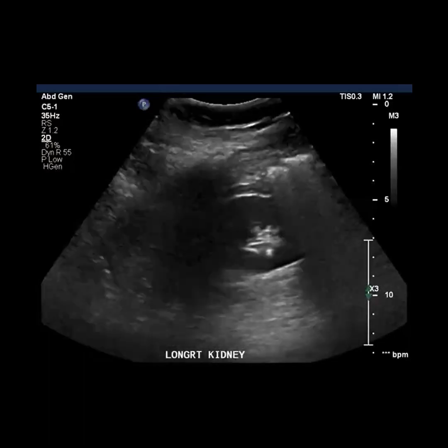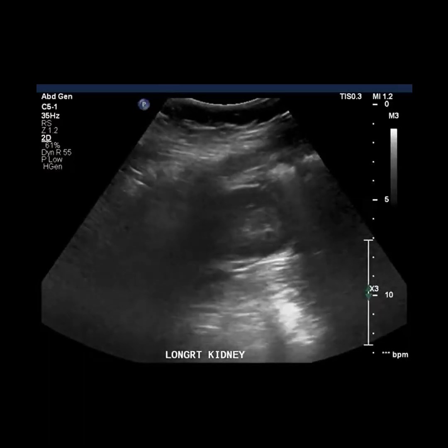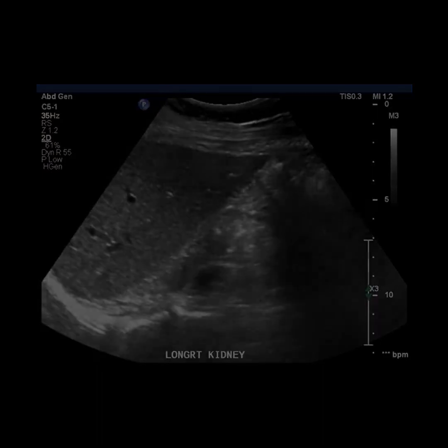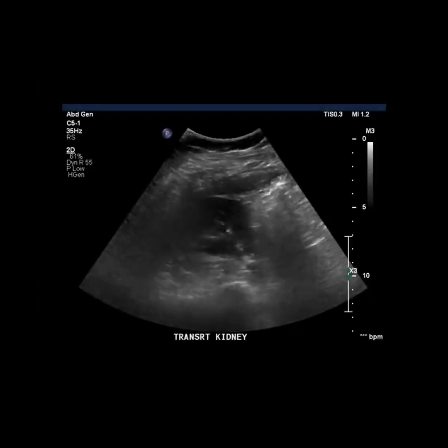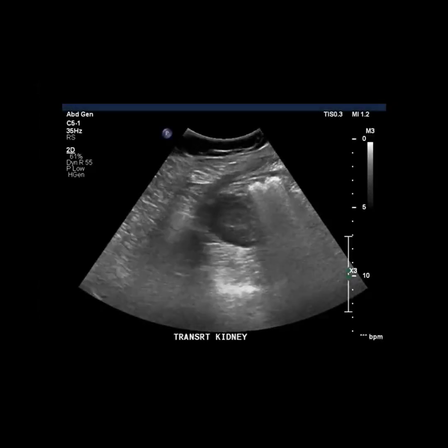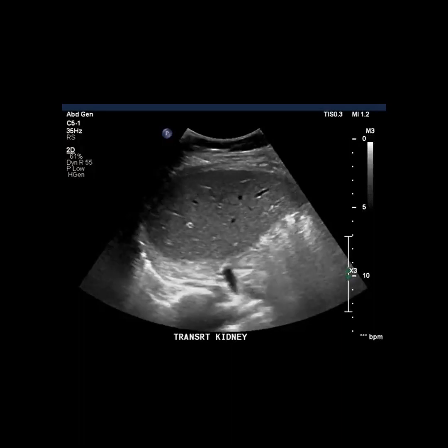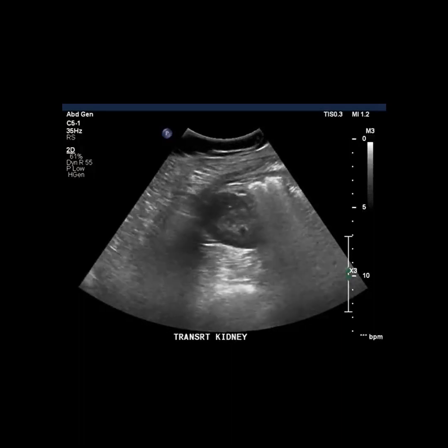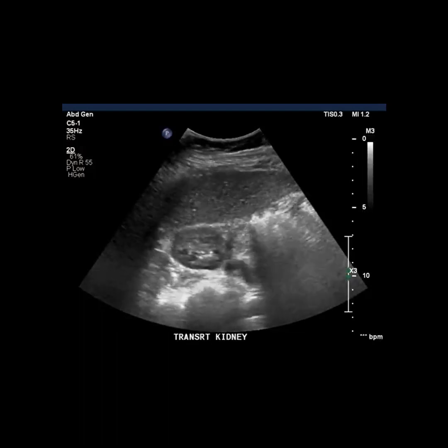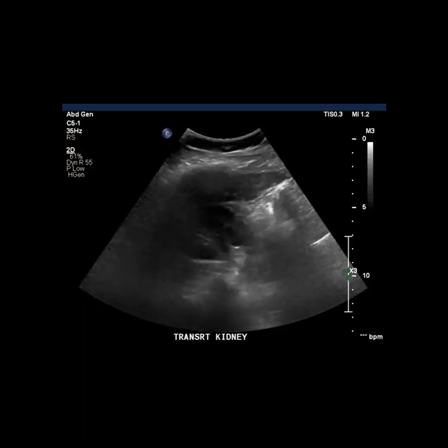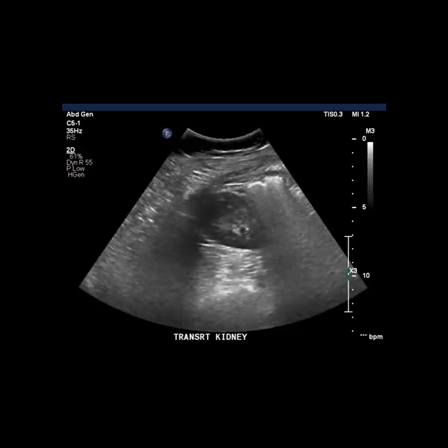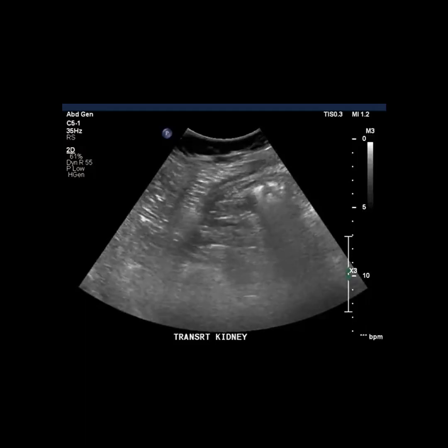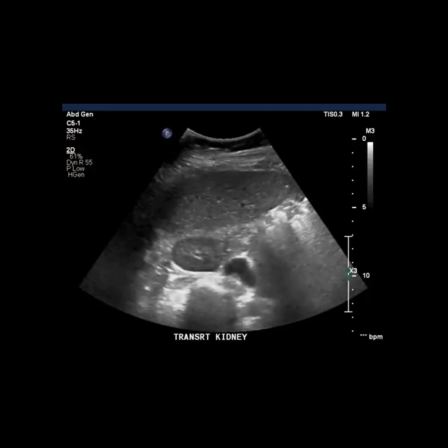The inferior pole of the kidney can sometimes be hard to see because of overlying bowel. Next, turn your transducer 90 degrees and you'll be set up to see the right kidney in transverse. Sweep all the way out of the superior pole and then all the way through the inferior pole, as cysts can be exophytic or hanging away from the main body of the kidney. Note that the kidney sits slightly oblique in the body, so you'll need to adjust your rotation to keep the kidney rounded.